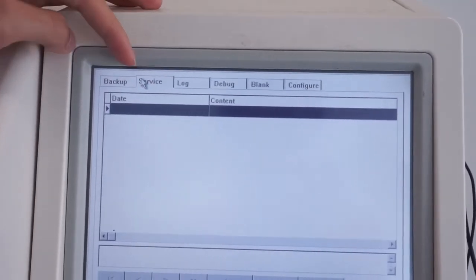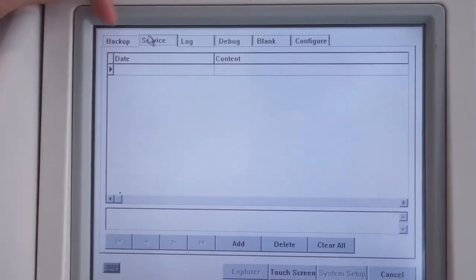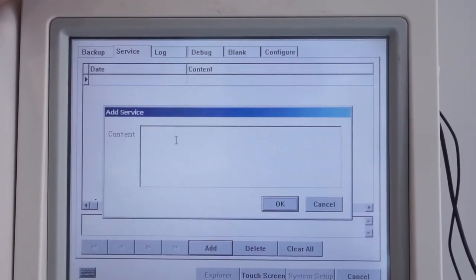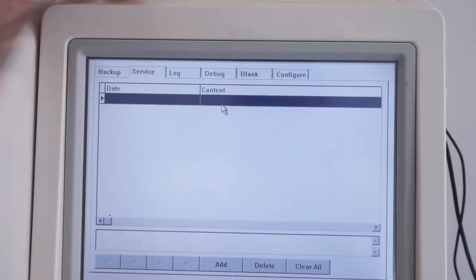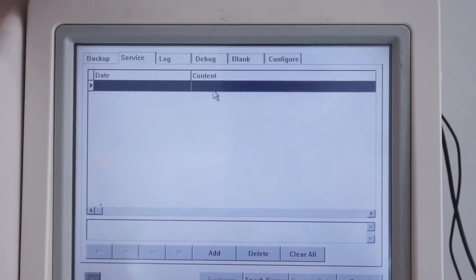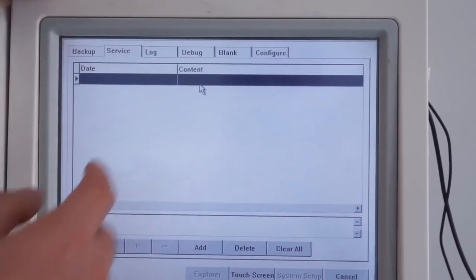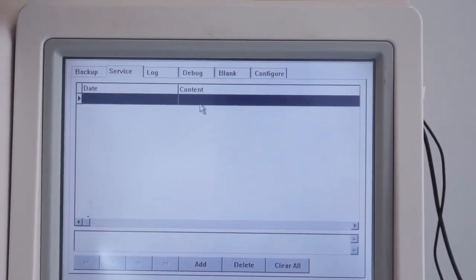The next one is the service. Service, for example, what do I mean by the service? Service has a date and contents. For example, input a new date. For example, I input the contact today. I input the contact, what maintenance to do on this machine. For example, I clean the dust on the fan. You can write it down here. And the next time you come here to check what action the engineer did to the machine, it will show also in here. Actually, you can make a mark here. So this is the service.